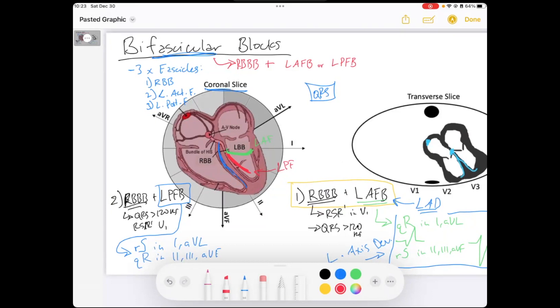This shows evidence that when the left posterior fascicle is not working, we get late forces going inferior toward that posterior fascicle. If you don't understand that, go watch the video where I dive into the mechanism behind fascicular blocks. Remember that anytime you have axis deviation and want to diagnose a fascicular block or bifascicular block, you need to make sure it's not explained by another EKG abnormality such as RVH.